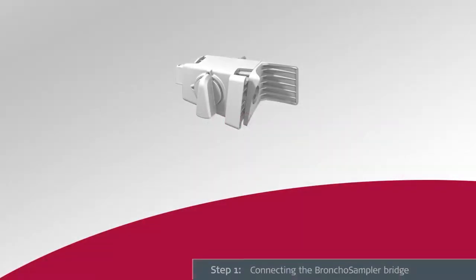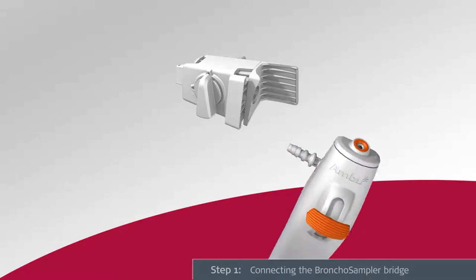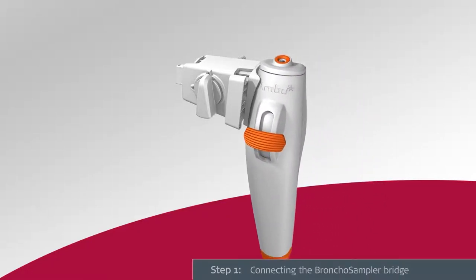To use the Bronco Sampler system, carefully connect the sampler bridge with the A-Scope IV Bronco by mounting the sampler bridge on the A-Scope IV Bronco suction connector, taking care to ensure a tight fit. Press the attachment lock button to secure the connection.